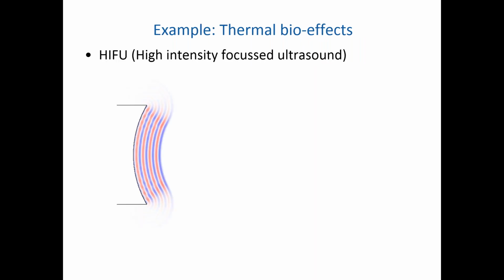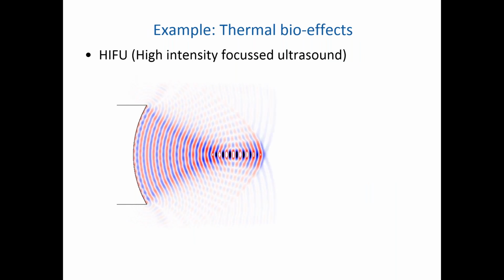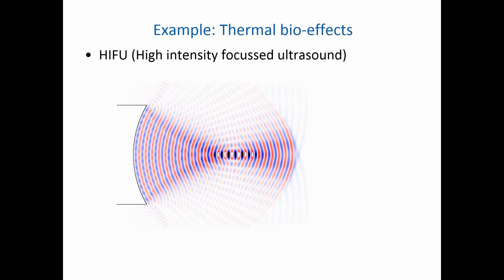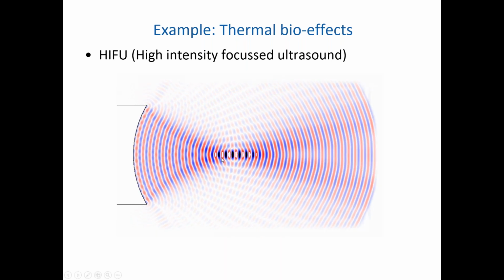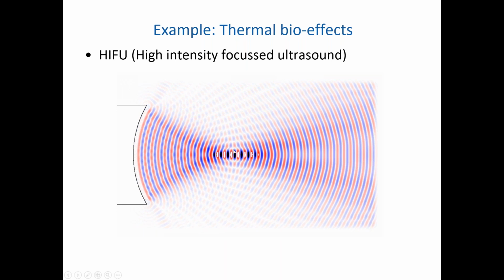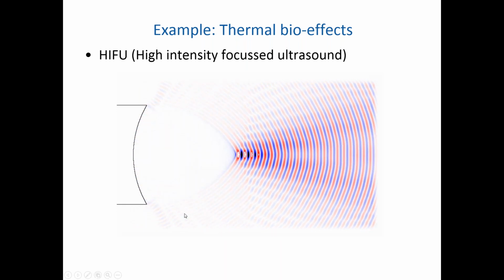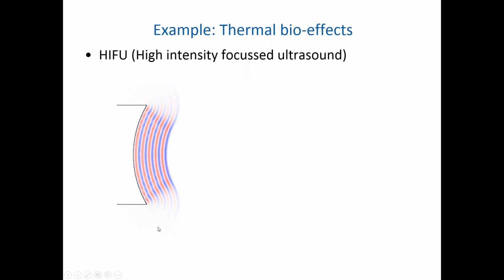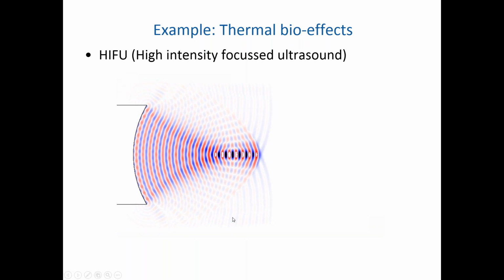We'll also now start to talk about thermal bioeffects. What I've got here is a simulation of a focused ultrasound beam. If we look at this, we see the focal region, which is this black and white cigar-shaped region that I'm highlighting with the mouse. This is the area where we've got the highest concentration of ultrasound, and you can see as all of those waves converge upon that point, there's a very obvious lozenge point.